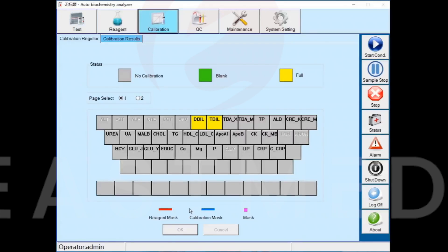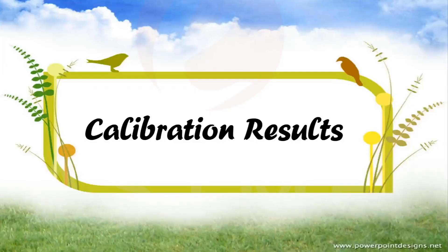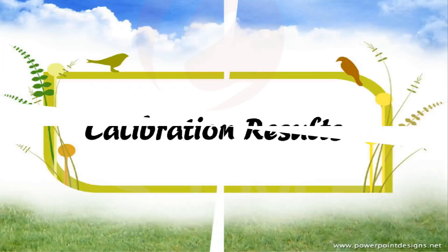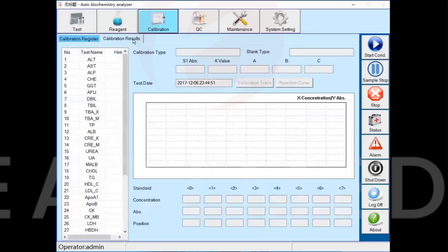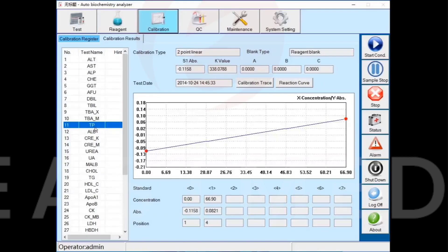Seventh part: Calibration Results. You can view the test results of the calibration in the Calibration Results interface.